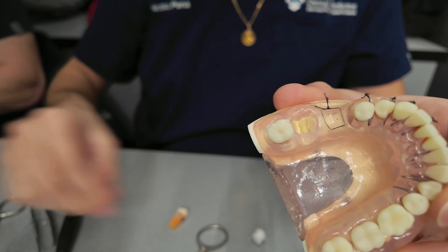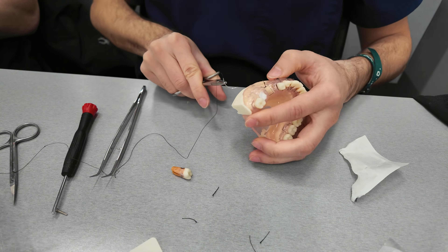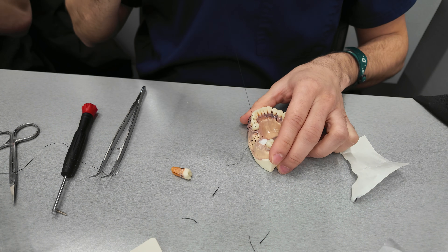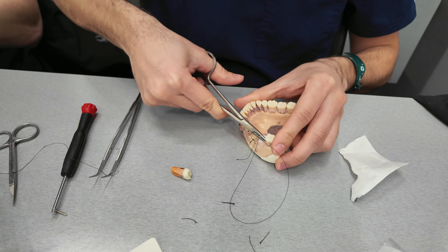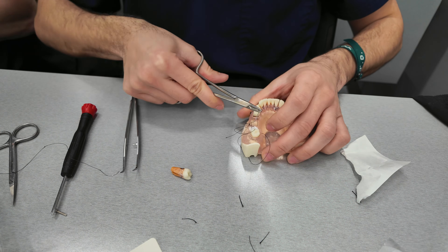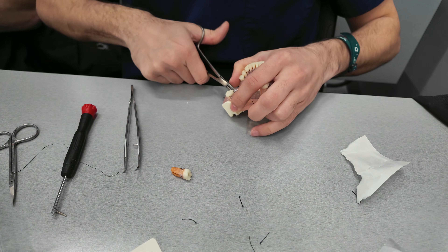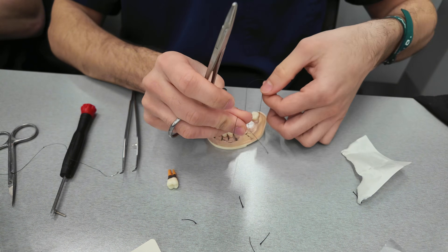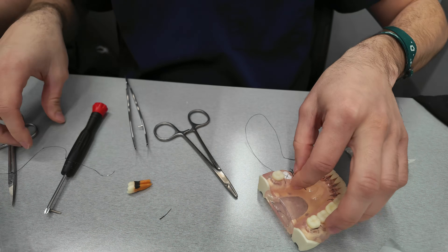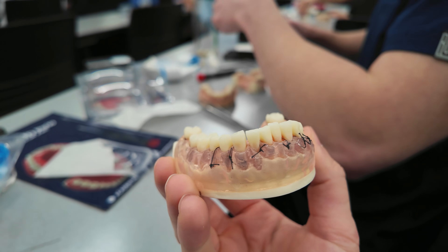The last technique we practiced was a crisscross suture technique. First, we extracted a tooth and placed a cotton pellet into the sulcus to simulate a collagen plug after extraction — this is done when you want to build bone level for implants. I was using my hands to pull the suture, which you shouldn't do, but my hemostat was extremely dull. Here's the final product — I think they all came out pretty nice. That wraps up the suture session.